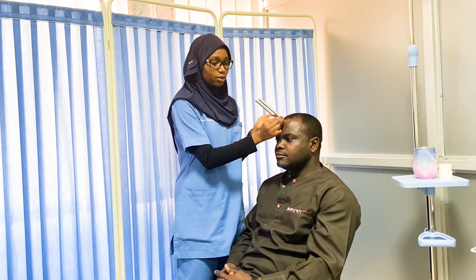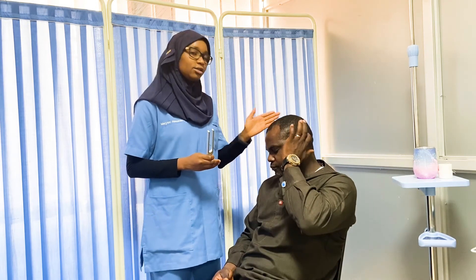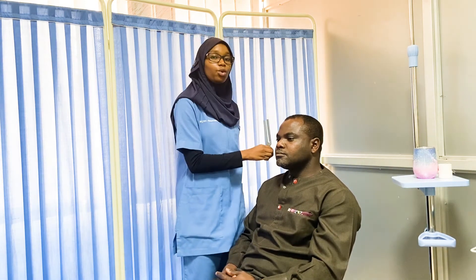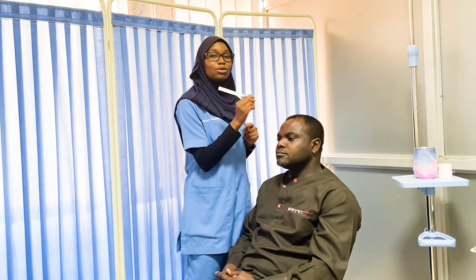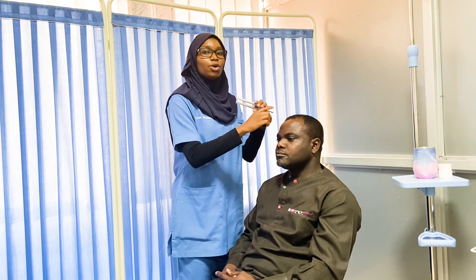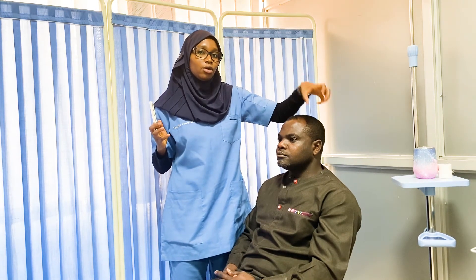Let's take a different example. Is it the same on both sides or louder on one ear? It's louder on one ear. This is another example of an abnormal Weber test — the sound is lateralizing to one ear. If we do the Rinne test and air conduction is more than bone conduction on both sides — meaning Rinne is normal bilaterally — but the Weber shows the patient hears it louder in one ear, this means the other ear has sensorineural hearing loss. The ear he hears it louder in is actually normal, and it's the opposite ear that is abnormal.